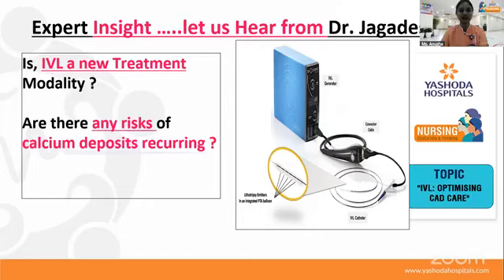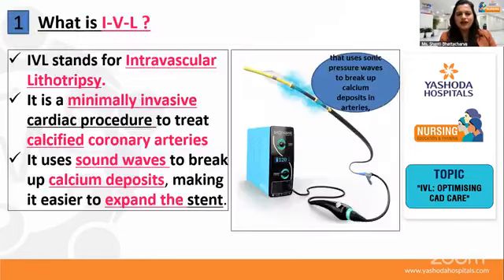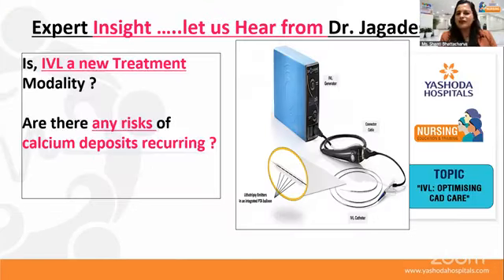So let us know about what is IVL. Yes, so we will have further discussion. Now, first, just go back to the previous slide. The first insight we would like to understand from sir, is IVL a new treatment modality? And as well, we would like to understand that, are there any risk of calcium deposits reoccurring after this procedure? Yes, your view about this.